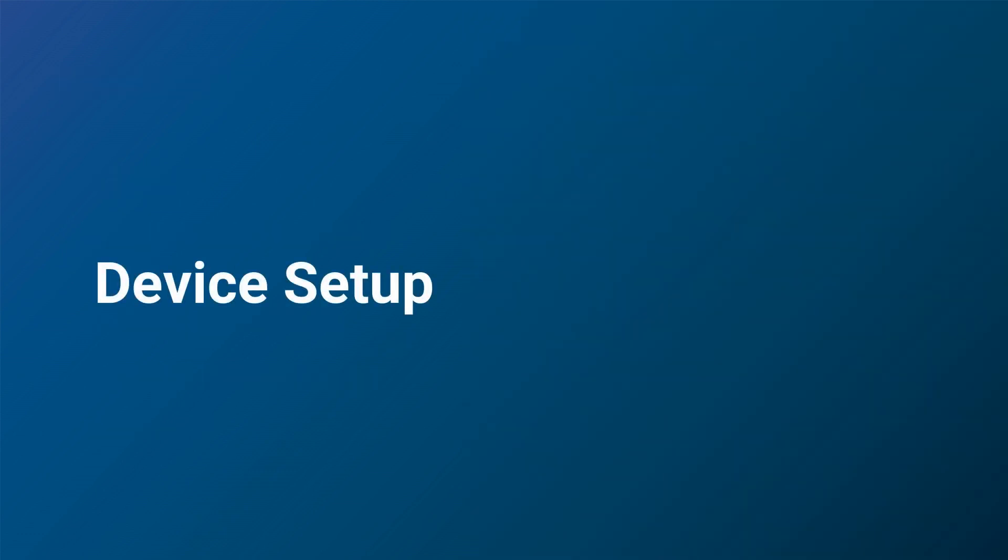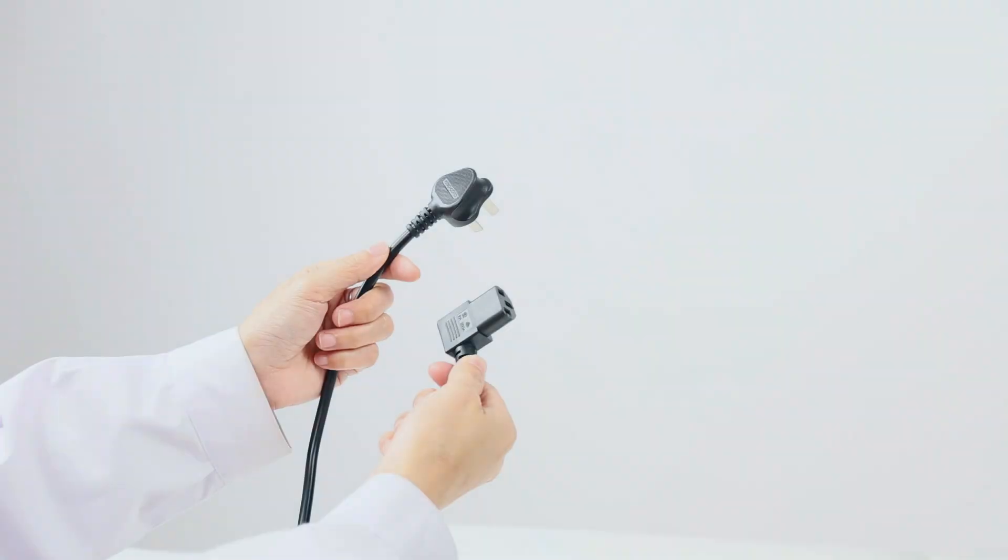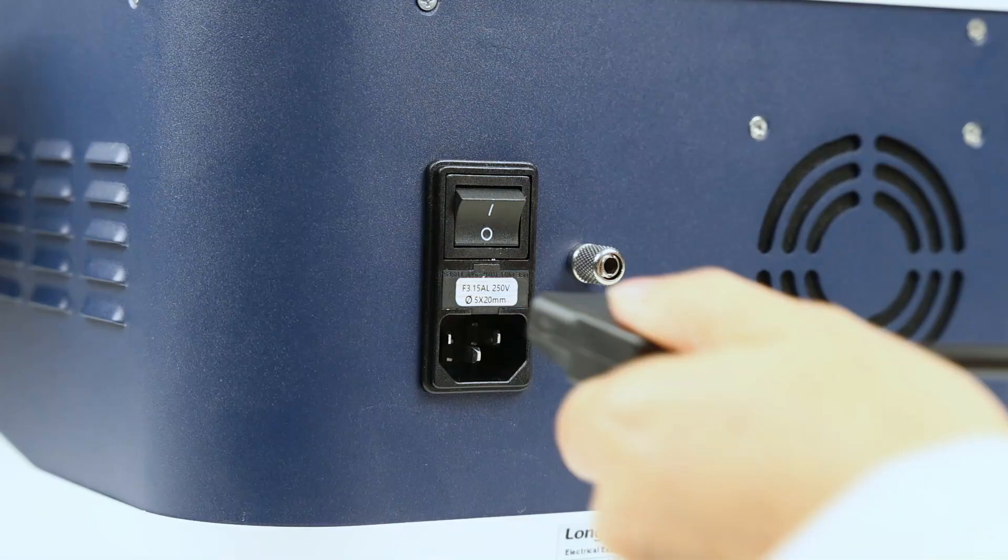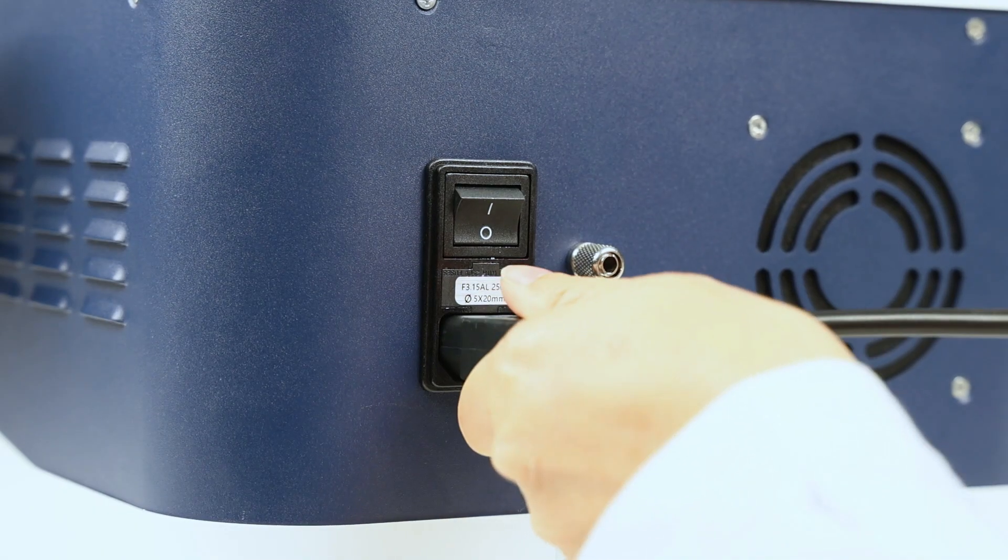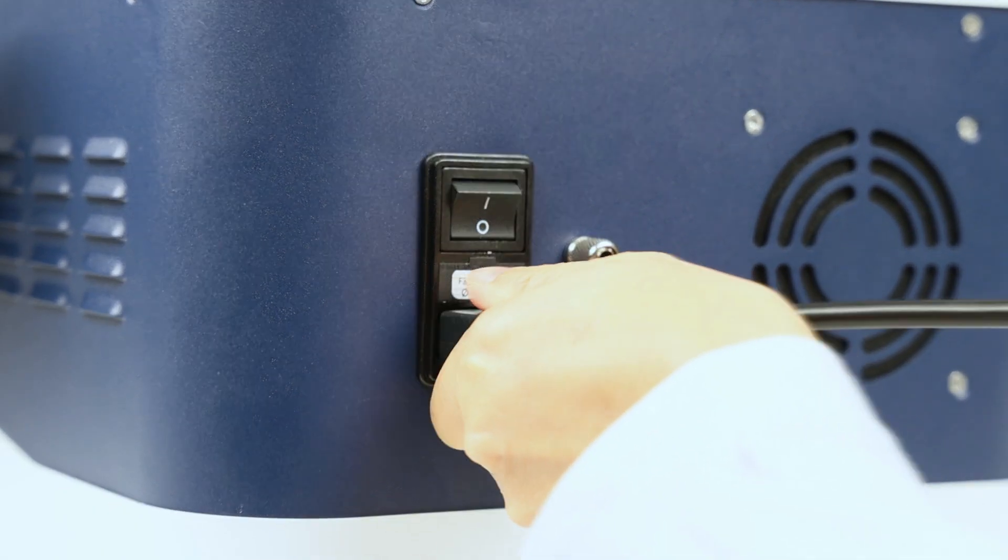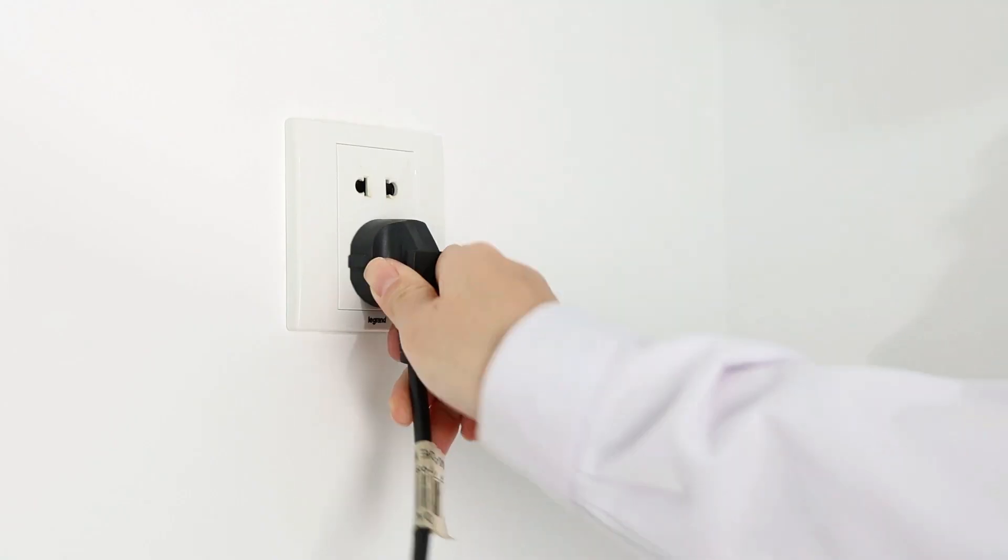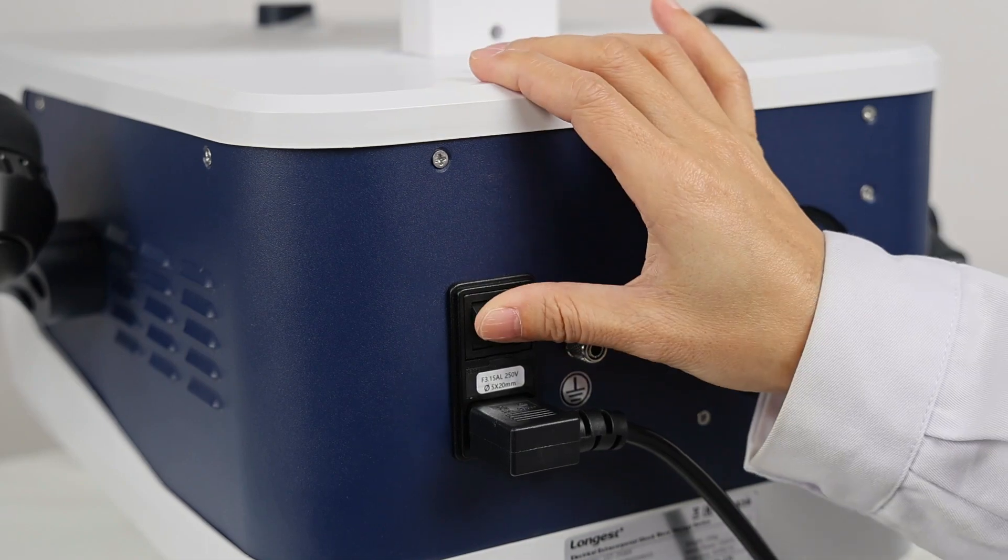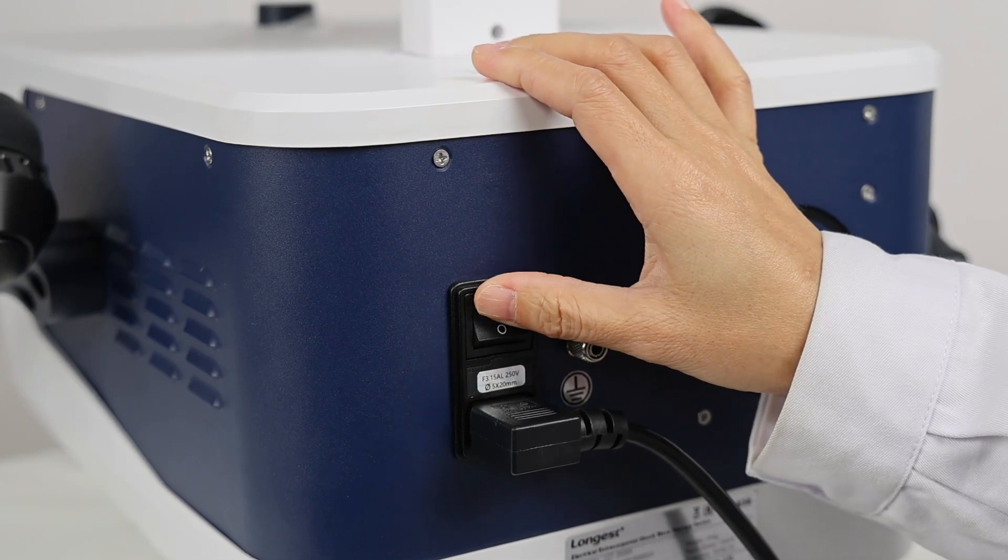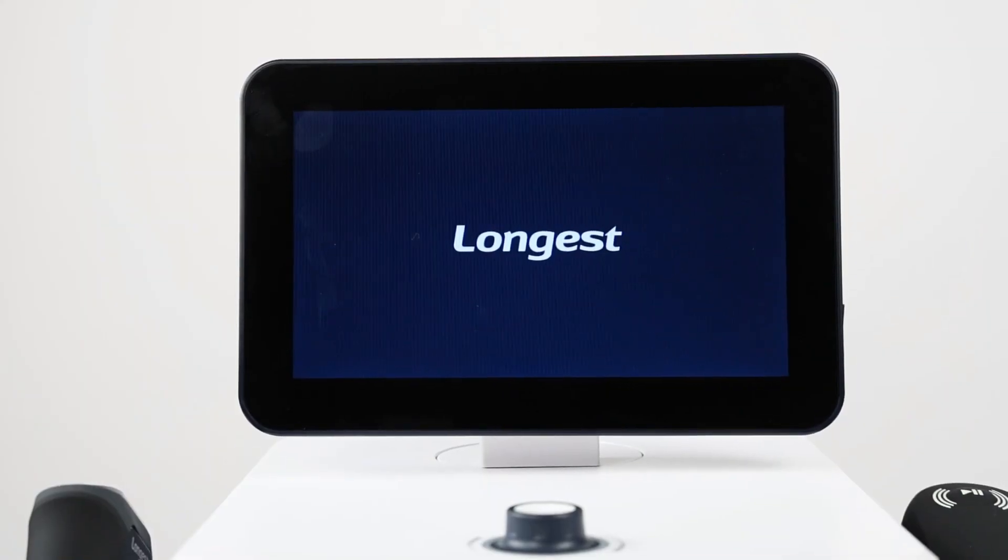Let's prepare the device for the treatment. First, power on the device. Connect the power cord and switch on the button to activate the device.